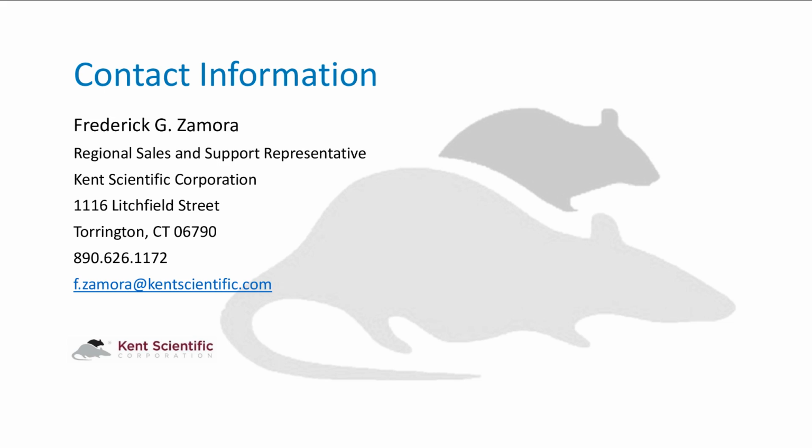Okay, perfect. Another question here. Can we maintain both induction and surgery flow at the same time? Sorry, can you repeat that question one more time? Can we maintain both induction and surgery flow, or anesthesia levels, I guess, at the same time?